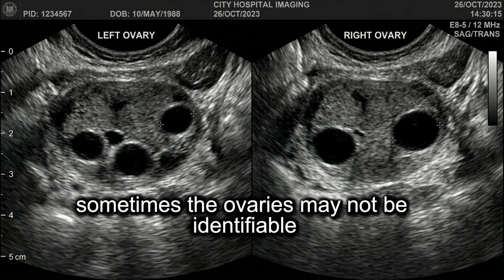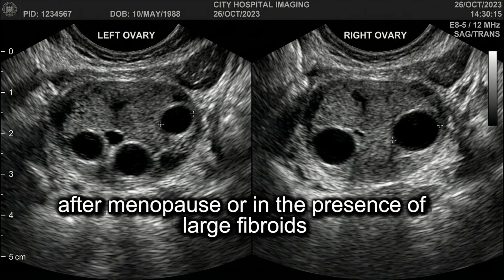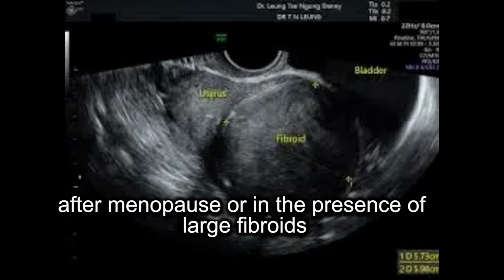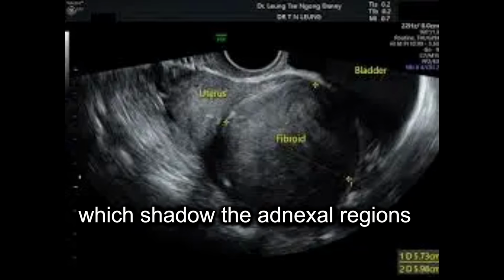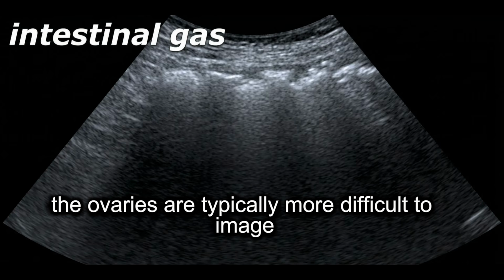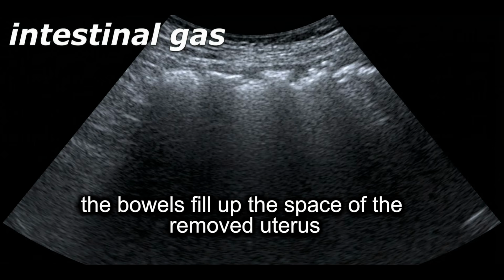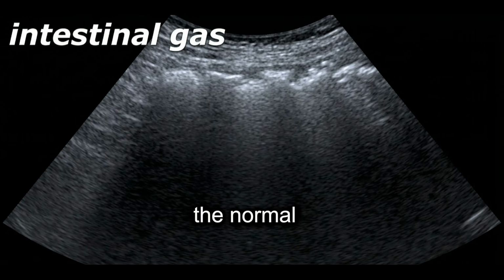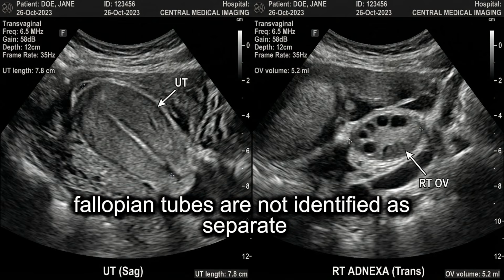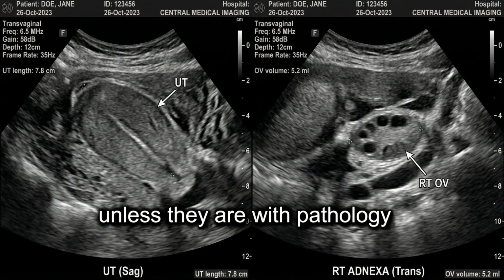Sometimes the ovaries may not be identifiable. This usually occurs prior to puberty, after menopause, or in the presence of large fibroids, which shadow the adnexal regions. In case of hysterectomy, the ovaries are typically more difficult to image because the bowels fill up the space of the removed uterus. The normal fallopian tubes are not identified as separate structures on ultrasound unless they are with pathology.